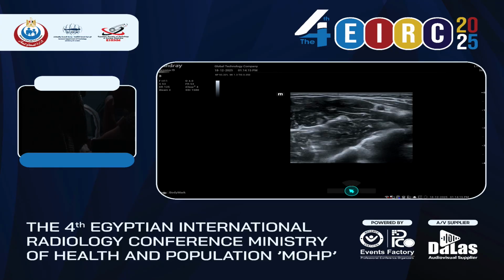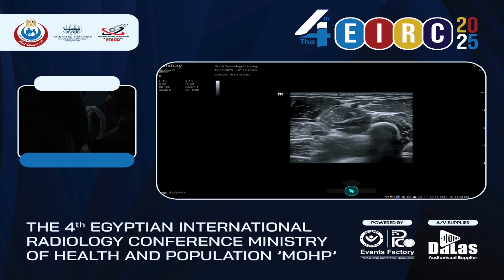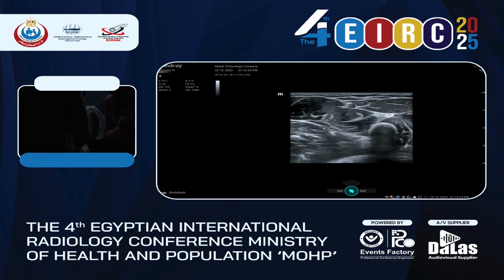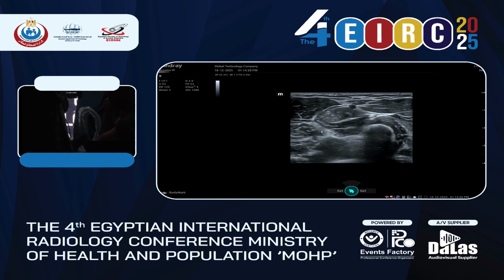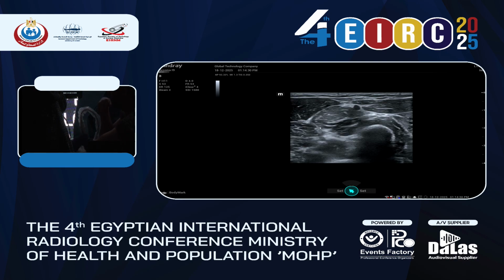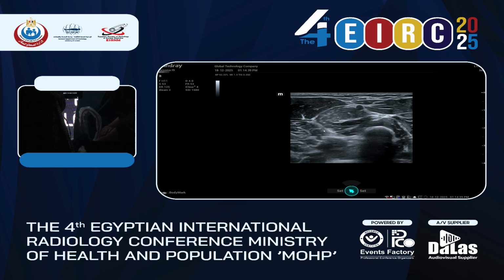We also have the pronator syndrome, which sometimes can be found at this area. Underneath the pronator muscle, the median nerve can be impinged by a big pronator muscle or by this very hyperechoic fibrous tissue. But again, we don't have a lot of findings in ultrasound. It is a clinical syndrome. We usually use it to perform diagnostic blocks.